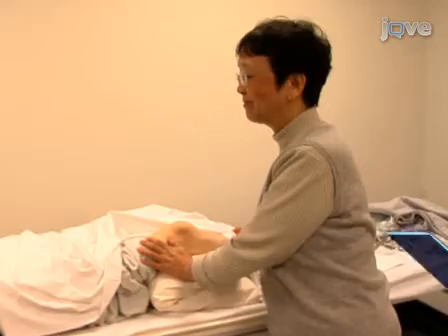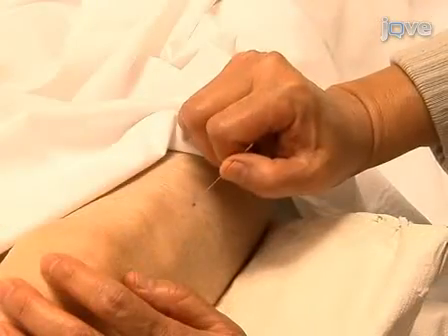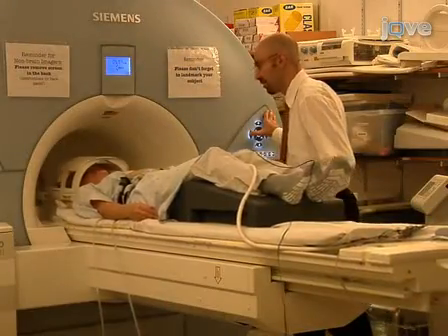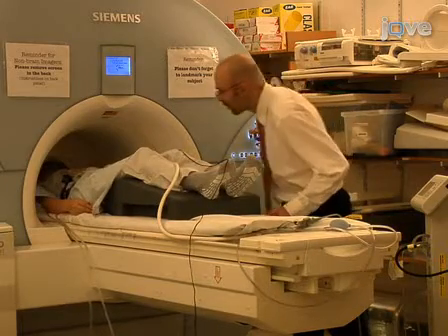Dr. Kenneth Kwong, MRI physicist from the Martino Center, directed the fMRI imaging in these studies. He will be delivering the concluding remarks. Ming Lee, practicing acupuncturist and research acupuncturist at the center, will perform the acupuncture procedures. Dr. Vitaly Napado, expert in acupuncture fMRI at the center, will demonstrate the data acquisition process with physiological monitoring. So, let's get started.